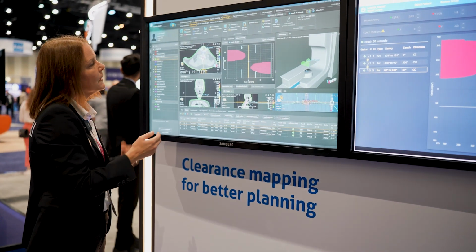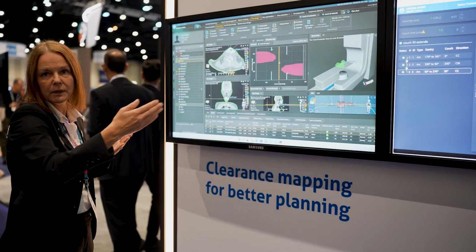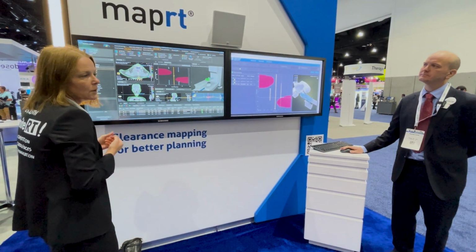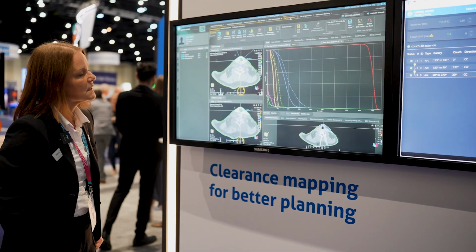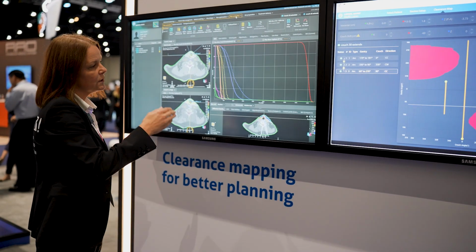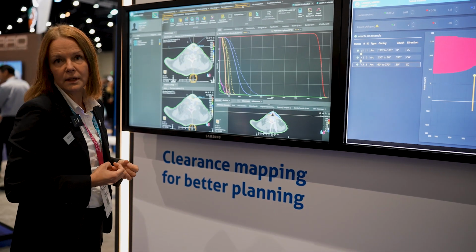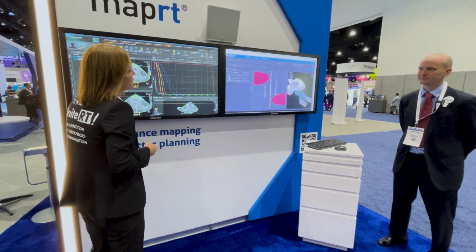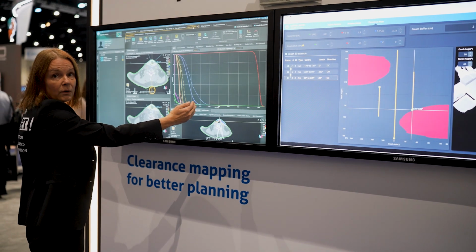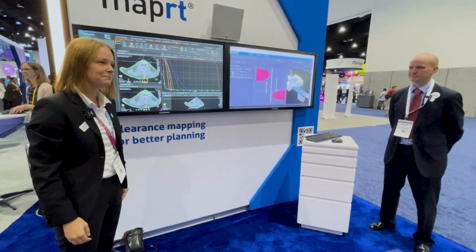to improve the dosimetry. And if we move into plan evaluation, we can compare this plan where we've utilized the space that we know of from VisionRT with the treatment plan where we have used standard treatment beams. So if we move into plan evaluation, we can see that if we compare a plan that we have created using just your standard beam setup with a plan that is created using the knowledge of VisionRT, with which couch kick we can use, we can see that with preserved target coverage, we can spare the risk organ to a much greater extent just by allowing ourselves to add a single couch kick into this plan.